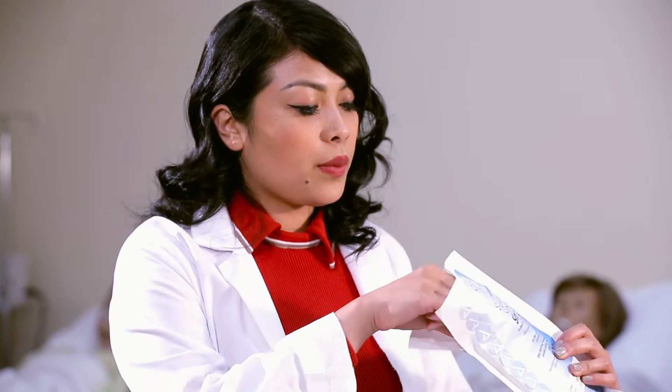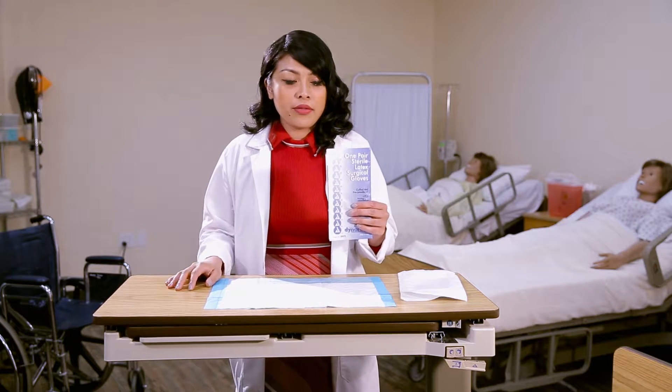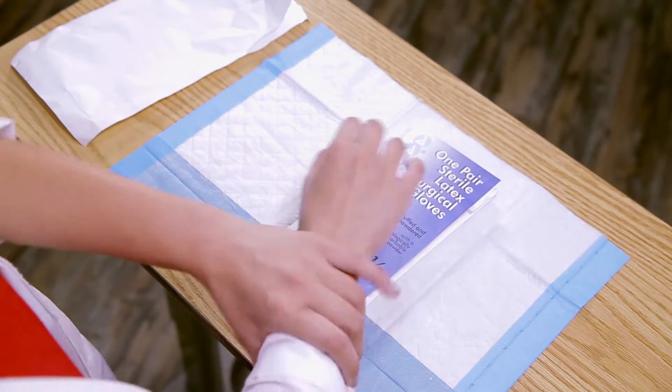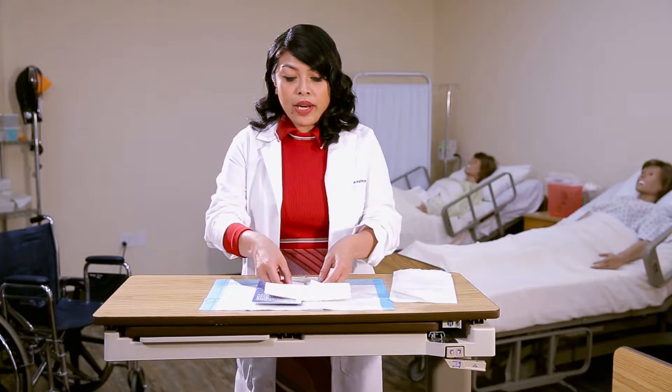Next we're going to go ahead and start the procedure. An important aspect to look at is to make sure that your wrists are showing, and if you have any jewelry, remove it. You're going to go ahead and open the package away from the body.